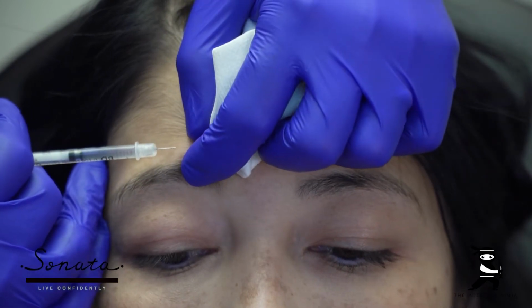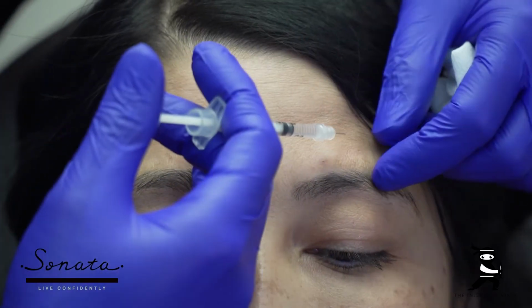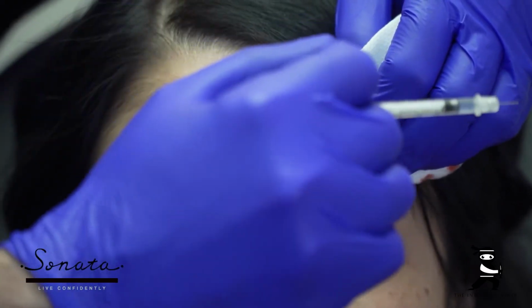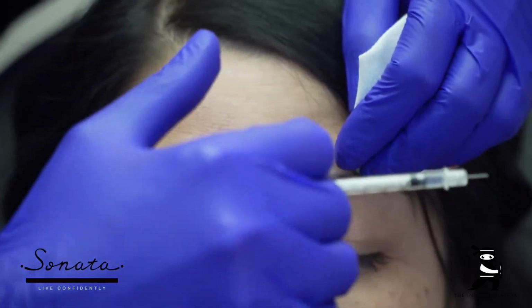We'll do one over here. And once again, we'll touch the skin, rapidly forward. This is not a full arm thing. We're not pushing the whole arm. We're just moving the fingers just a little bit like that.